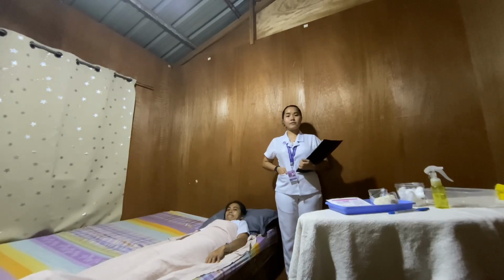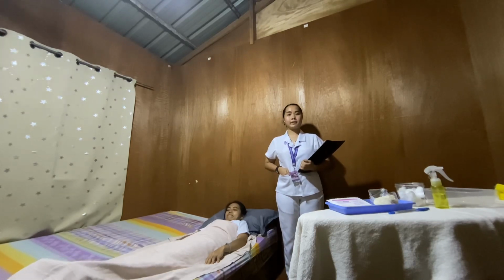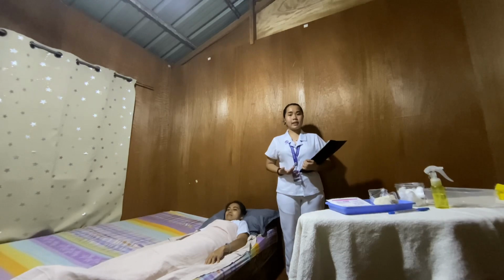I am from ESN 12 Section F, and today I will be performing my return demonstration about parenteral drug administration, particularly the intradermal injection. This is to provide the medication that the client requires for allergy testing and TB screening.